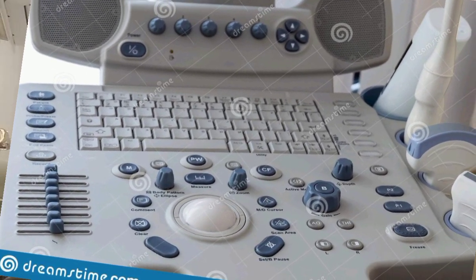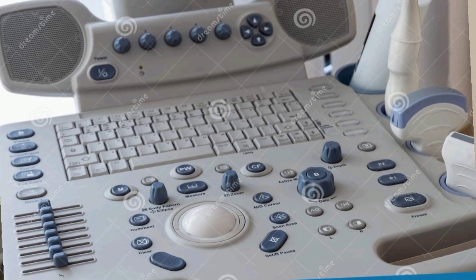Now, to maximize the use of the instrument, there are many operator-adjustable controls available which affect the information on the image.